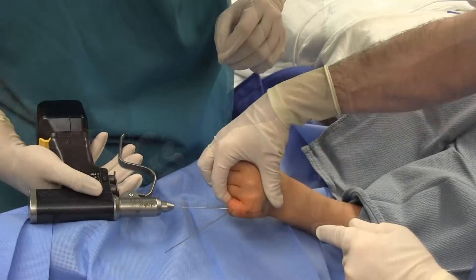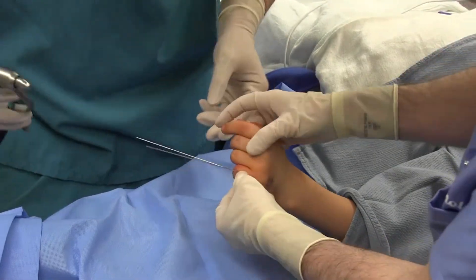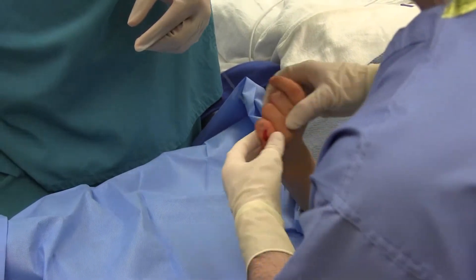Fluoroscopy was used to assess pin fixation. The k-wire was then removed as the fracture had provisional fixation.